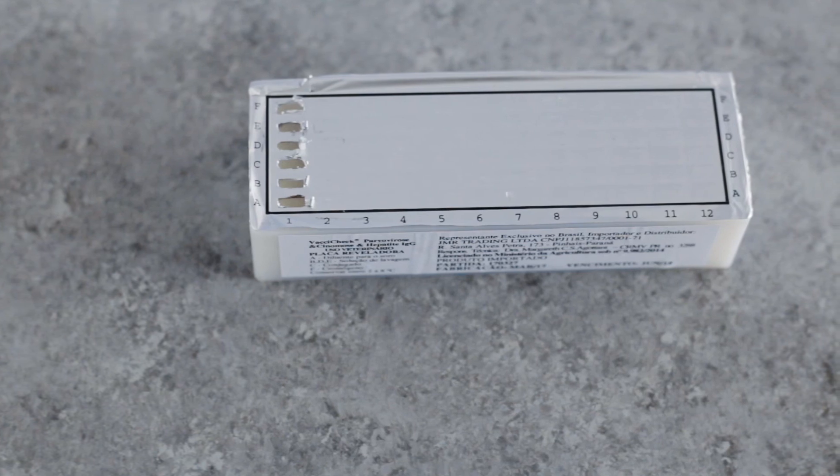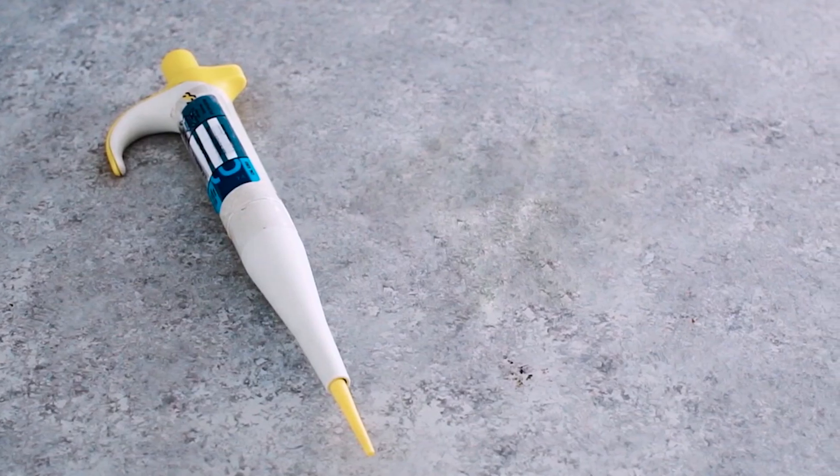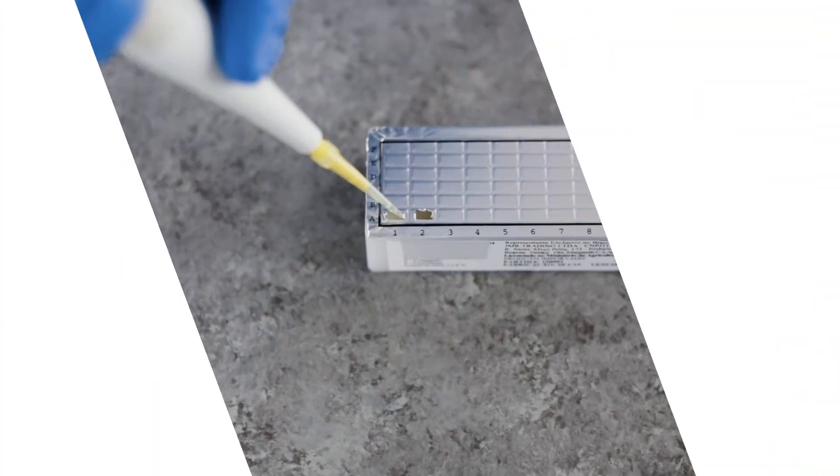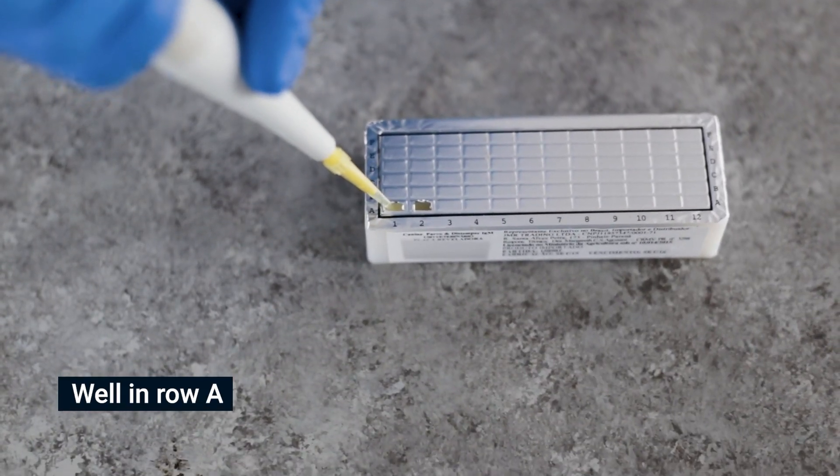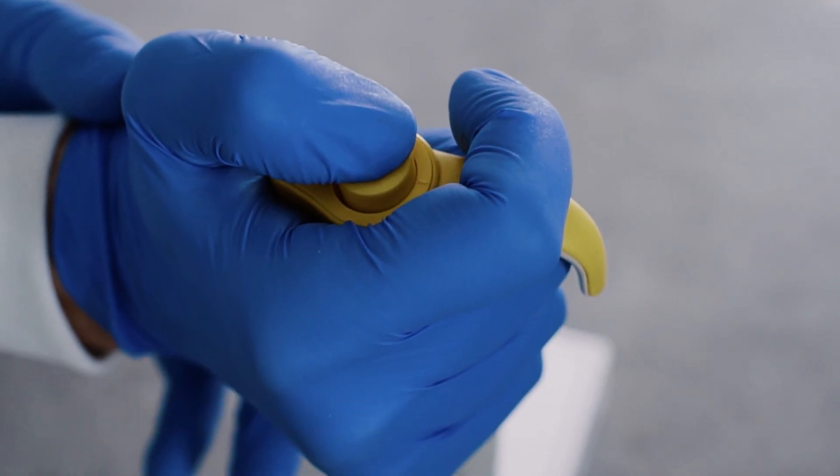For the test, use a micropipet to deposit a sample into a well in row A. Raise and lower the pipet plunger several times to mix properly, then discard the tip.